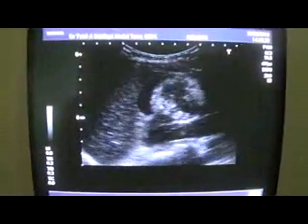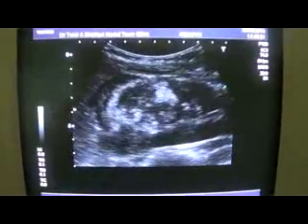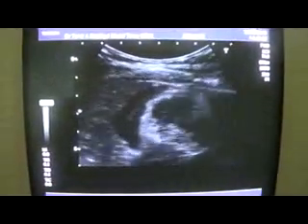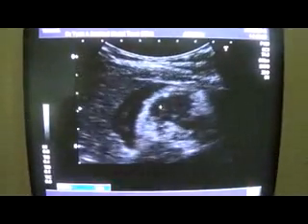You can see it moves with the kidney. This is the longitudinal section of the right kidney. The mass is solid and echogenic with an internal cystic area, and if I magnify it, you will see tiny calcifications present within it.